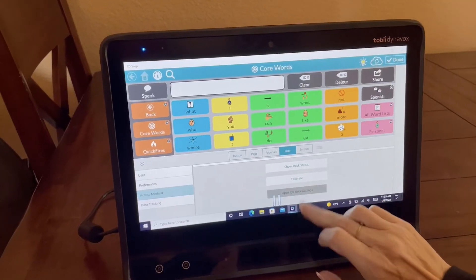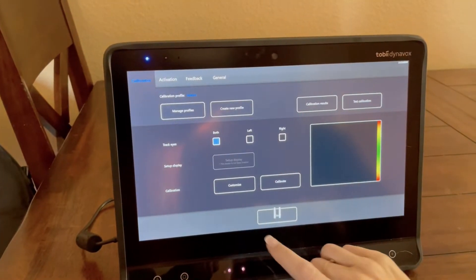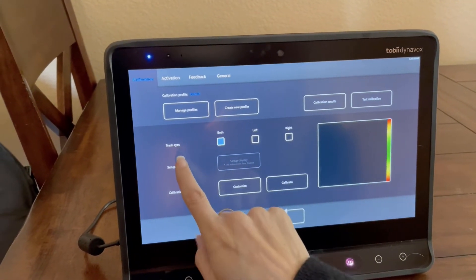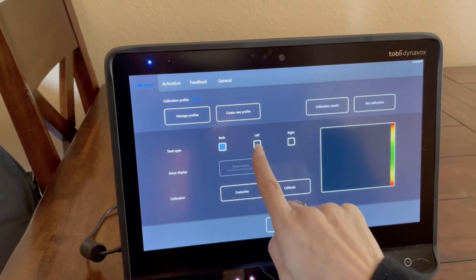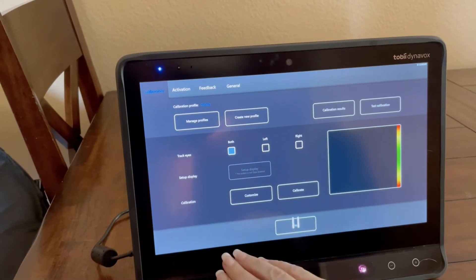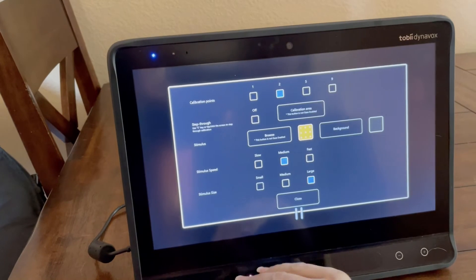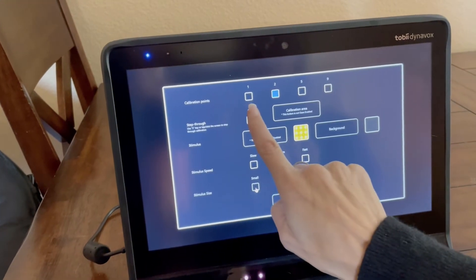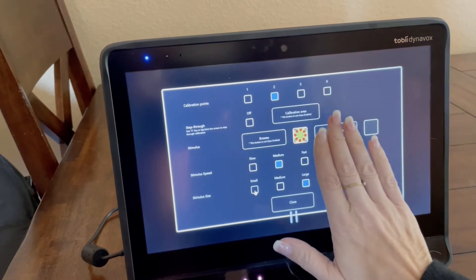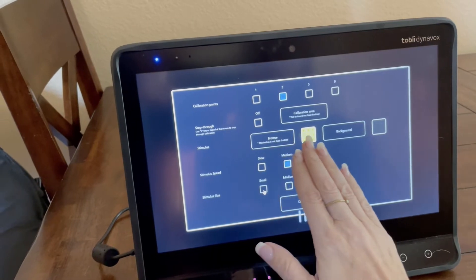You can open up eye gaze settings and manage how you want it to track — one eye or both eyes. You can customize your calibration by selecting a one, two, five, or nine point calibration.